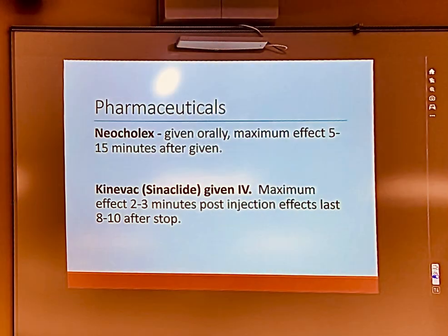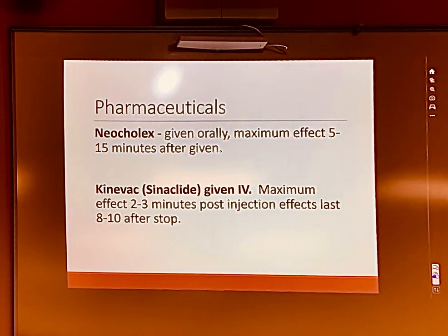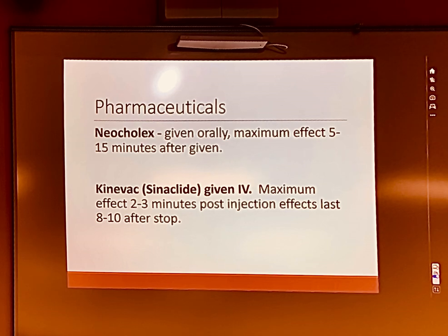If they get nausea or a sweat, you'll spend a lot of time with your gallbladder patients next to their bed, fanning them because they're hot from the hot flash from the CCK. Usually in 3 minutes they start to feel better, and by 5 to 10 minutes they're back to normal the way they came.